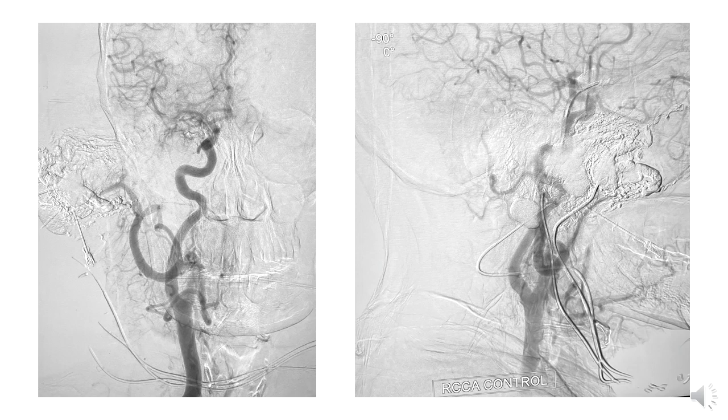Common carotid artery injection control, we can still see the needles which are embedded within the tumor. We can see all the normal arteries are filling. We can see that the tumor is completely devascularized. Obviously this is a global run, so the better visualization is on the selective ECA and further injections downstream. But this is just to show that we have not caused any complications and such things, and also to produce a nice image for the social media and paper publication and presentations and all.